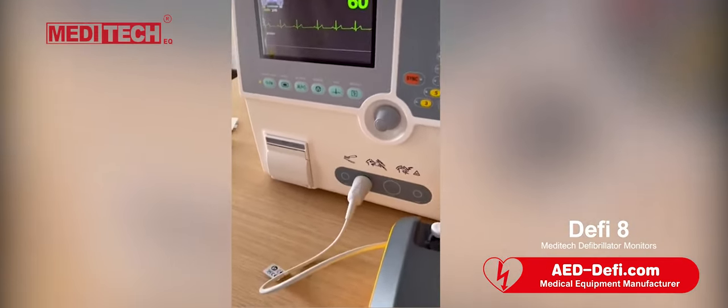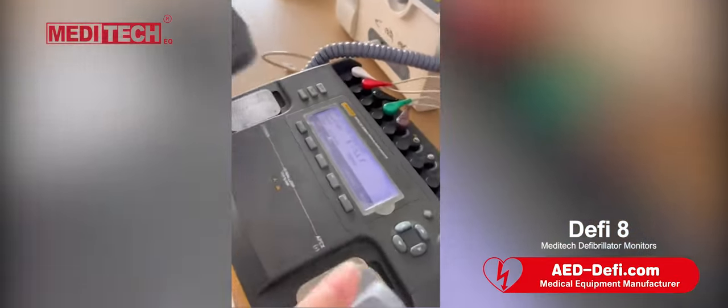Let's do the discharge. Press this button.